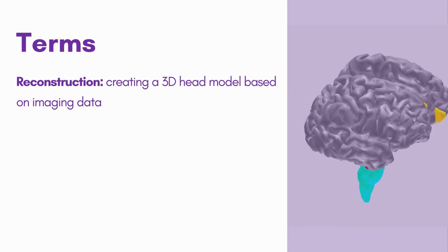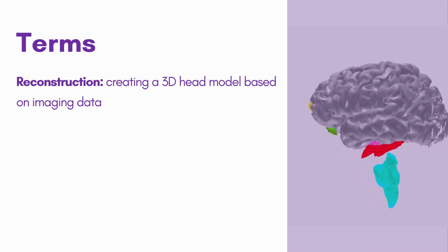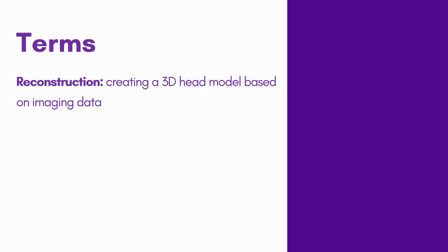Reconstruction is the process of creating a 3D model of the brain from raw data, such as images from MRI or CT. The primary goal of reconstruction is to generate a detailed and accurate representation of the brain's structure. This reconstructed model can then be used for further analysis and simulations.